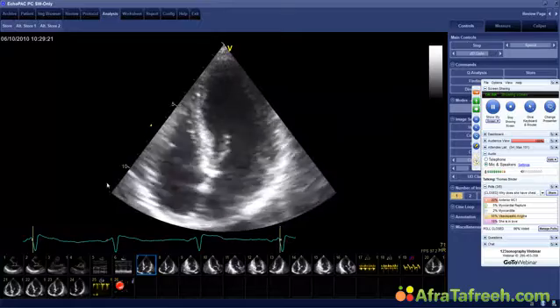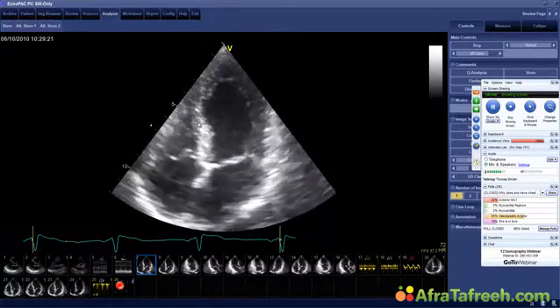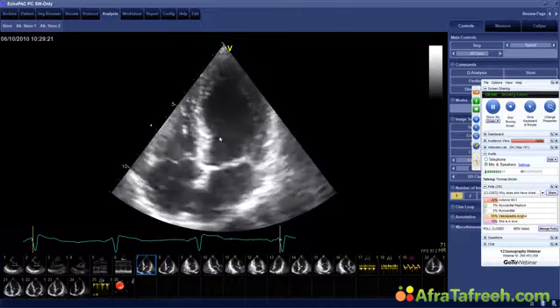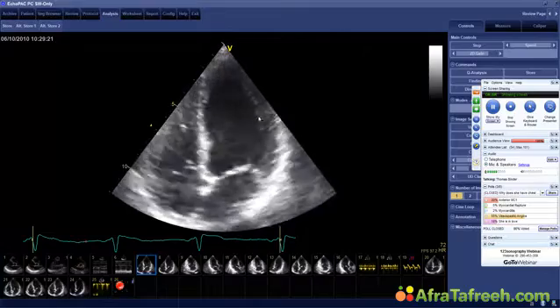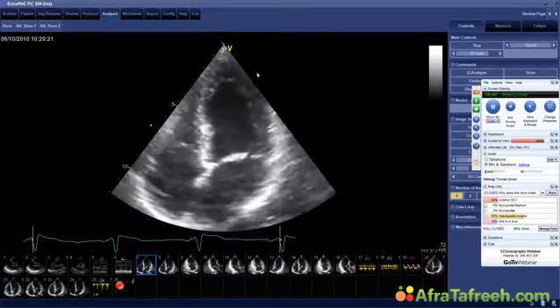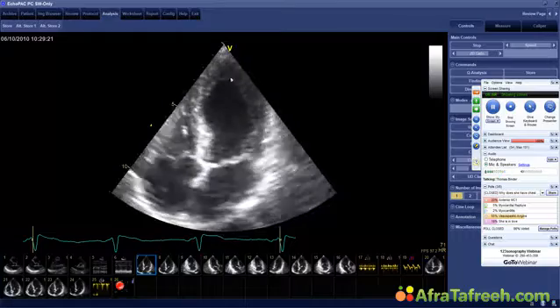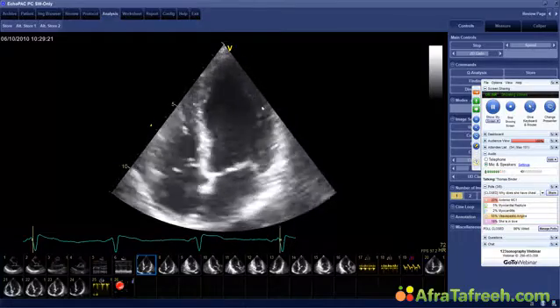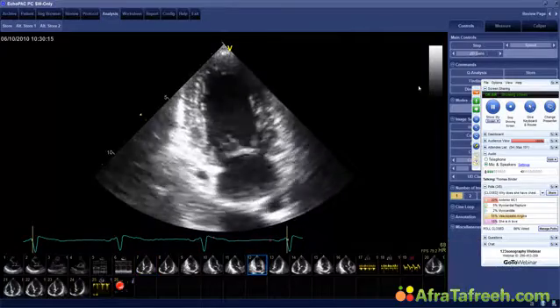This is the 4-chamber view, and what is clear here is that there truly is a wall motion abnormality in the apex. You can see that the basal segments contract quite normal, but the apex does not contract normal. There's actually an outpouching of the ventricular cavity, almost some form of ballooning of the left ventricle. And this can also be appreciated in a 2-chamber view.